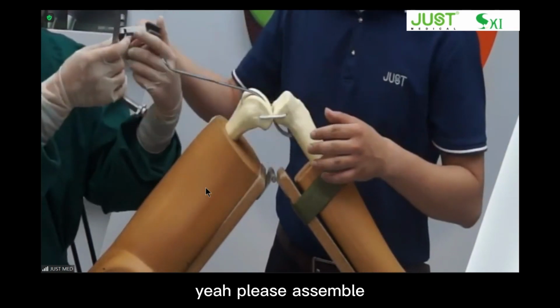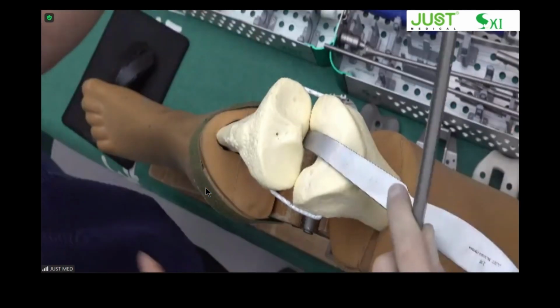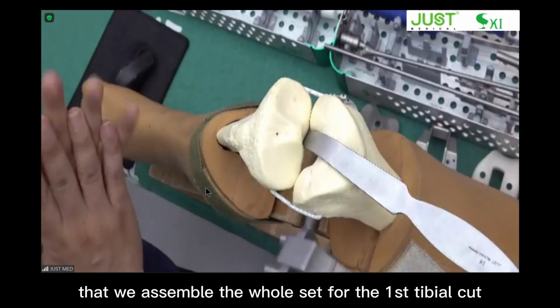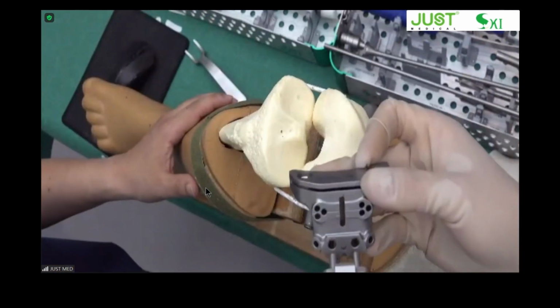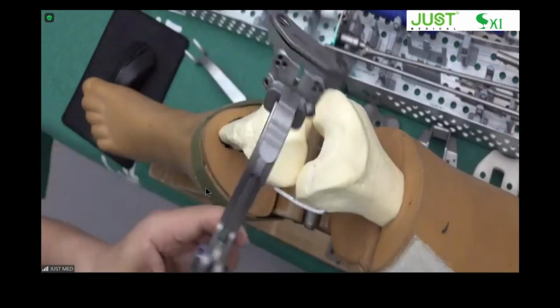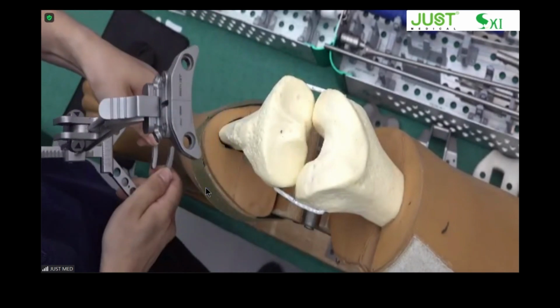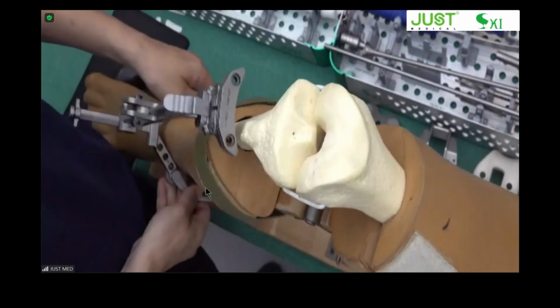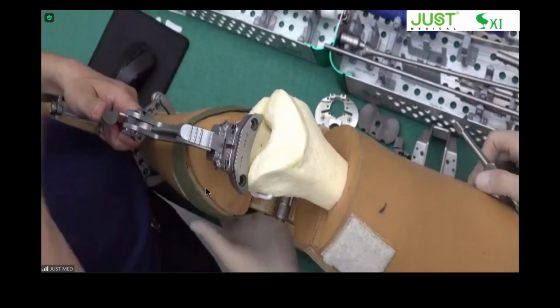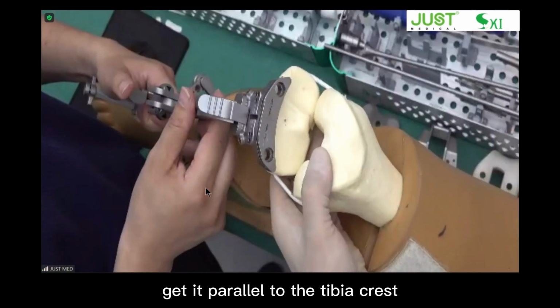Yeah, please assemble all those components. Yeah, we assemble the whole set for the first tibial cut. Okay. So with the knee flexed, we place the arm of the ankle clamp around the distal tibia. Get it parallel to the tibial crest.